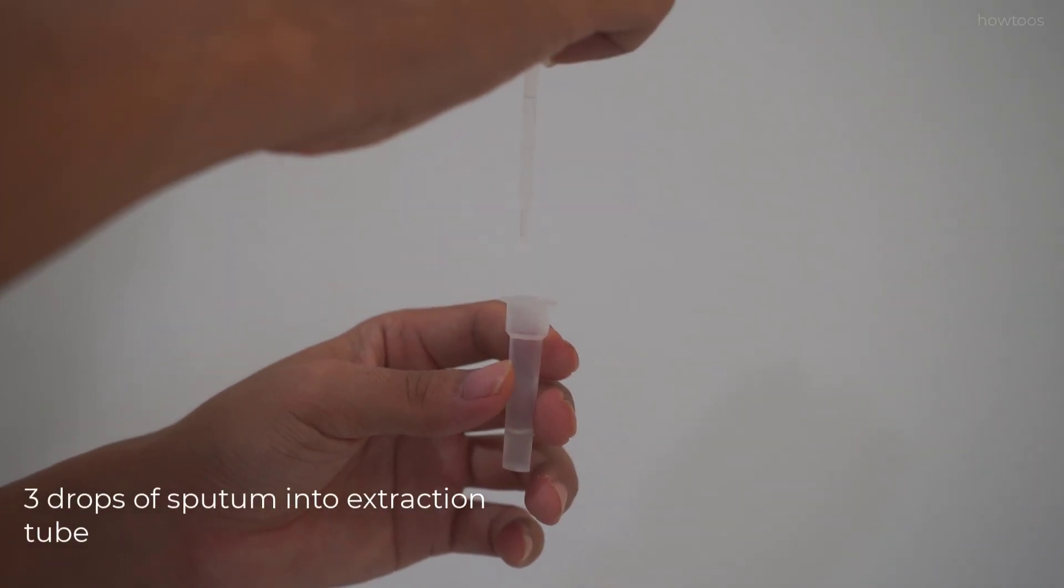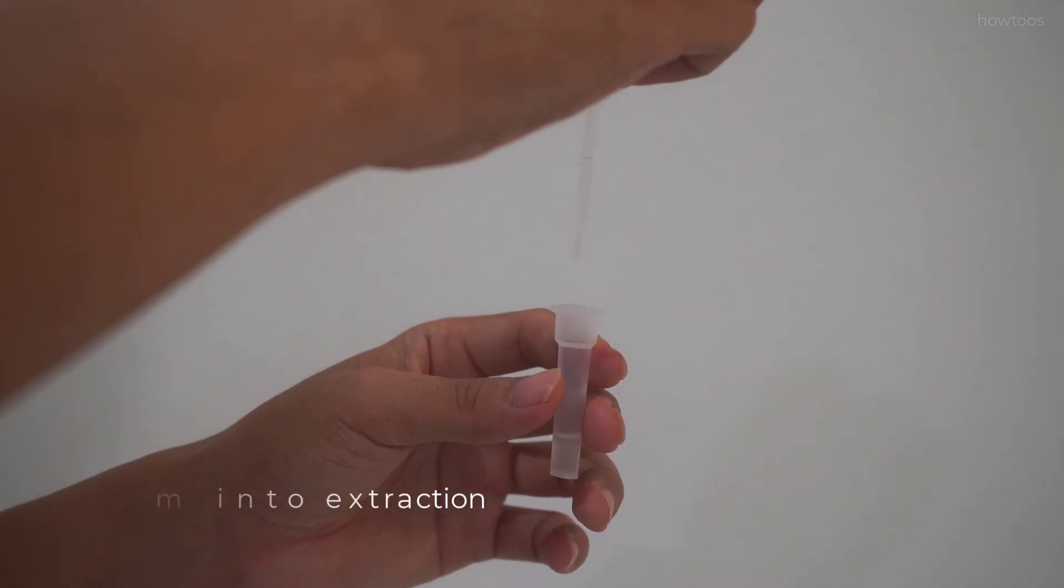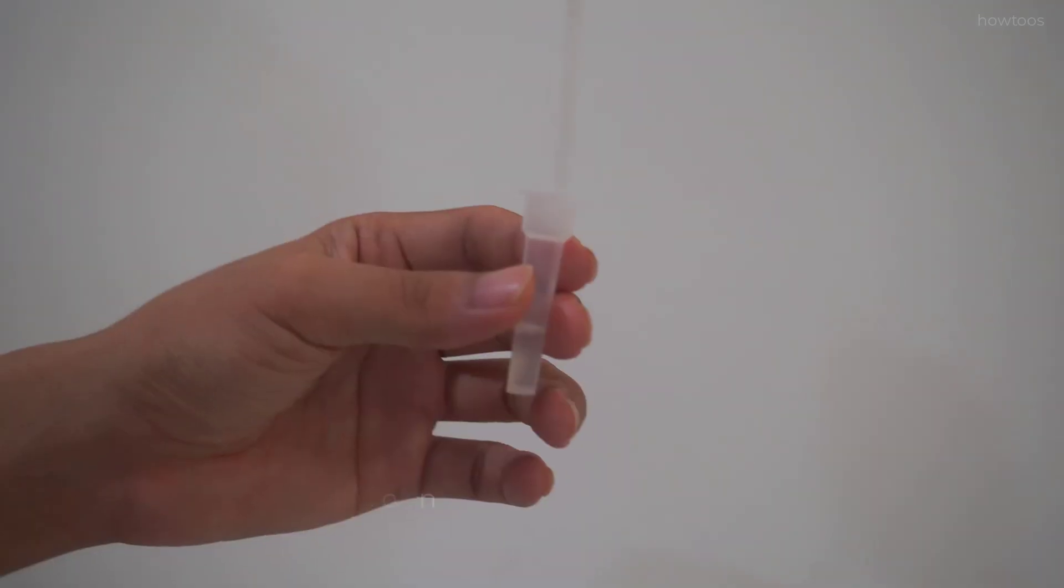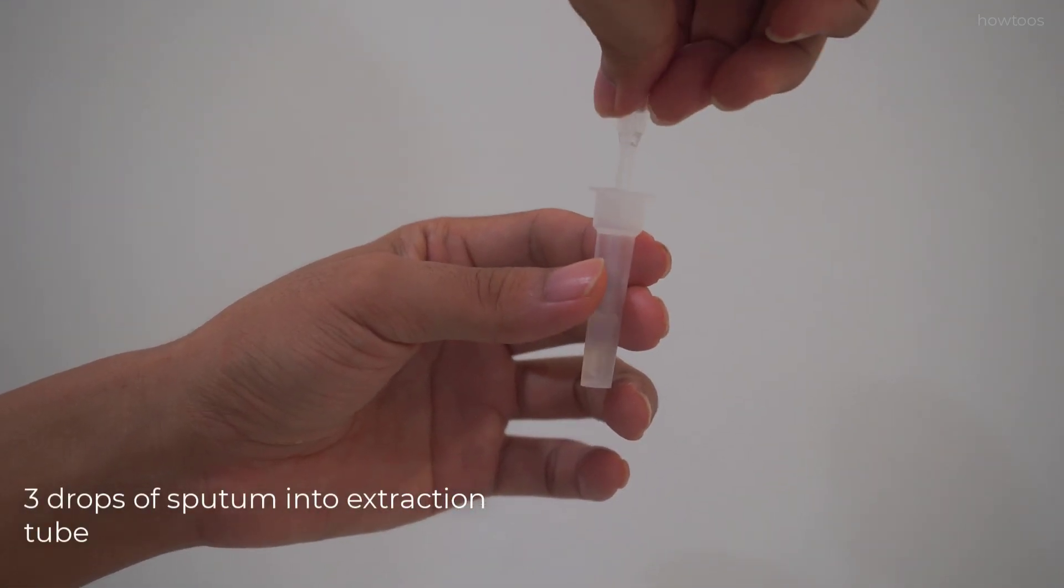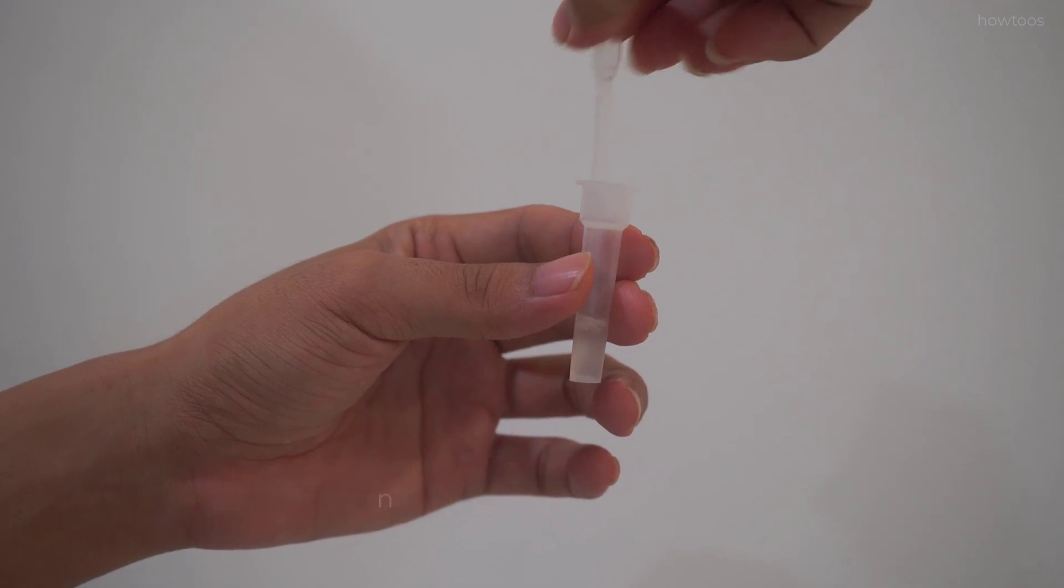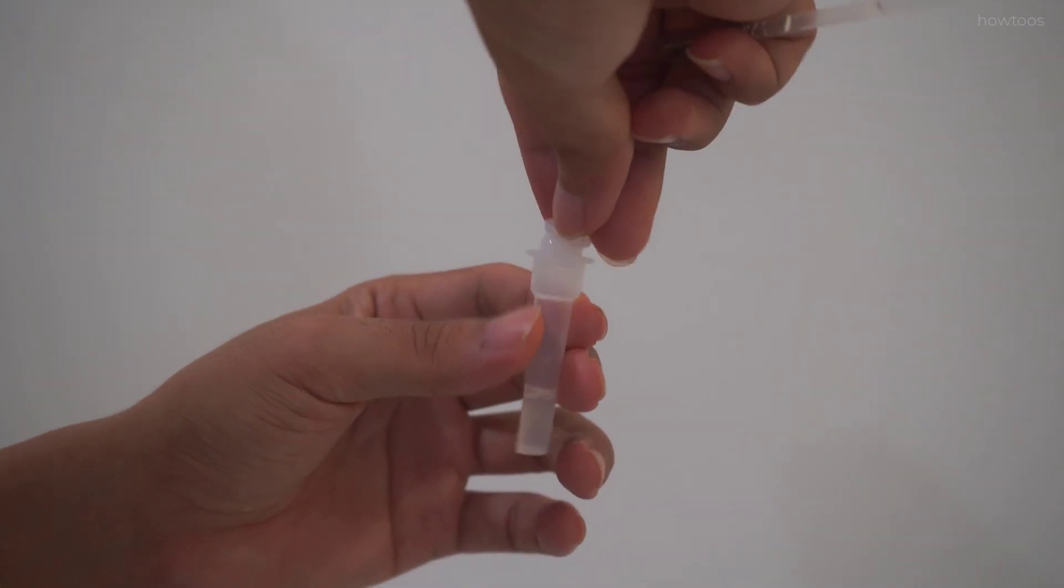Expel the excessive sample back into the paper container. Squeeze the dropper five times to mix the sputum sample with reagent. Close the tube with the provided cover and leave the sample for one minute.